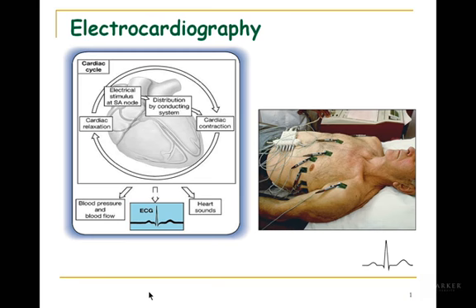The ECGs do not record action potentials. What they record is total electrical activity that's generated by the heart. And just keep in mind why we're able to do this is that electrical activity that's created by the heart is transmitted through the saline solution. We're a big bucket of saline, which is a very good conductor of electricity. This is why it's transmitted up to the body surface where we put these electrodes.